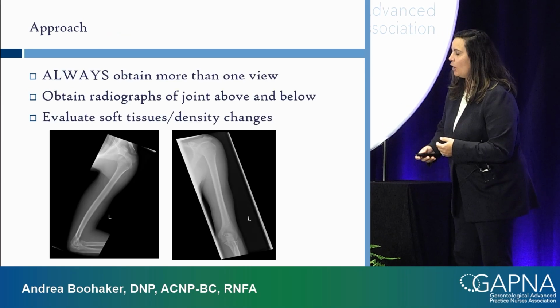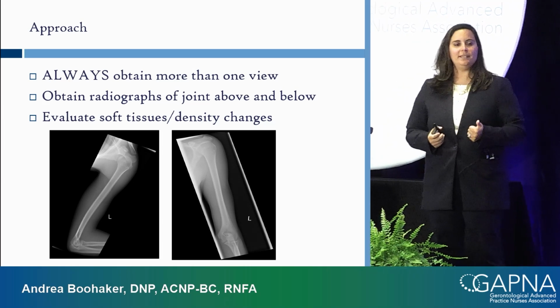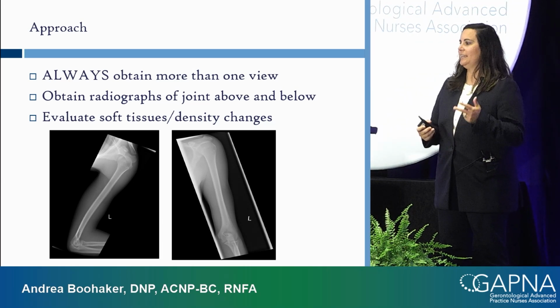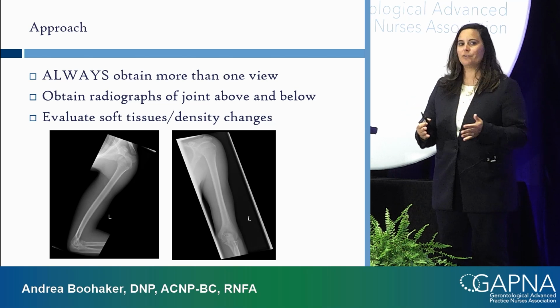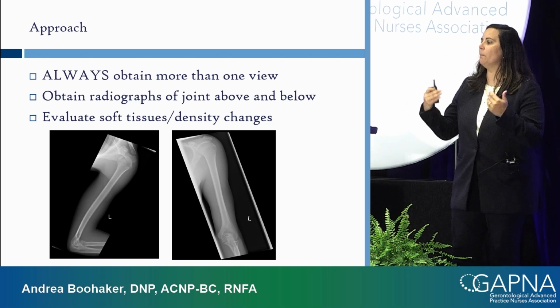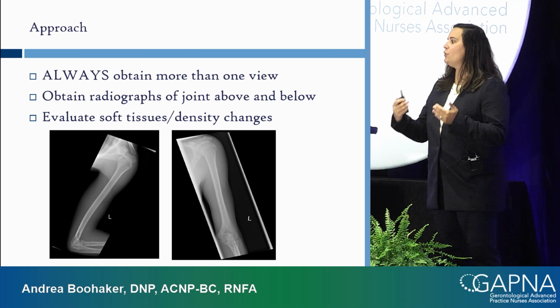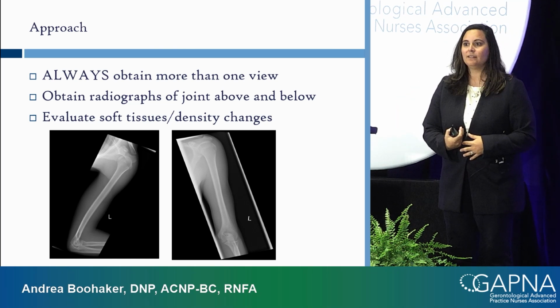Okay? Okay, so what's our approach? Always, always, always get more than one view. All right? I cannot overstate that enough. You will miss a fracture. You will miss a diagnosis if you rely on one view. You want to know how I know that? Because I did it.